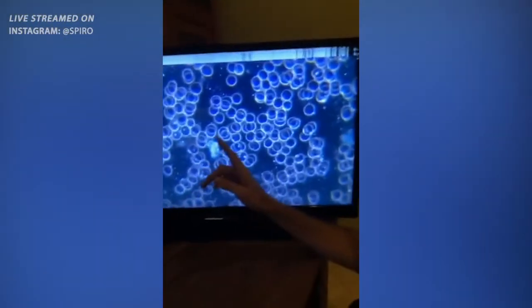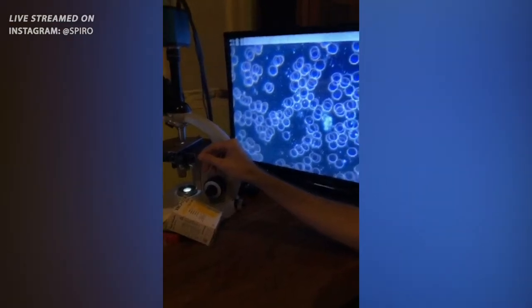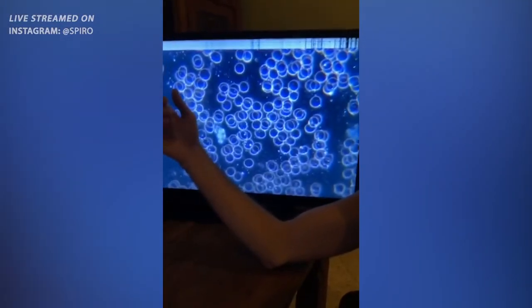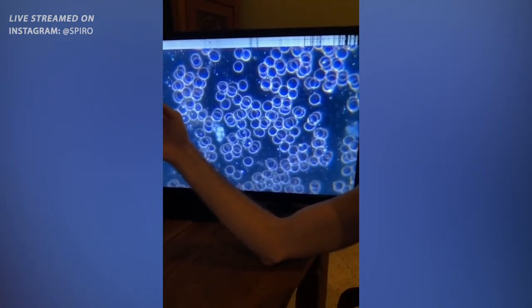Because I think it would be more interesting to do it live with a vaccinated person. Take his blood out, live, so we can show it step by step, and we can view it on this technology here. We can view it live as it's moving. Now this is the doctor's blood, so this is healthy blood. This is good blood cells.